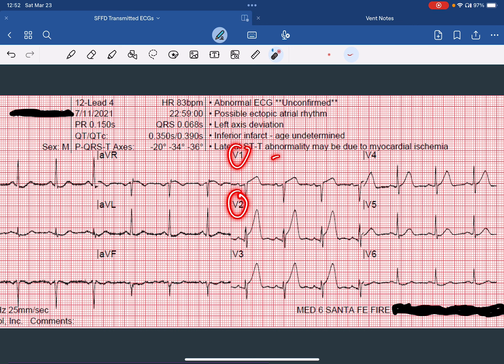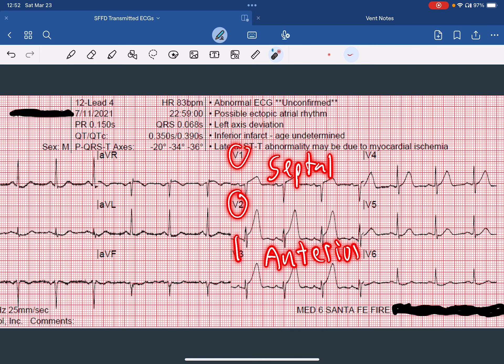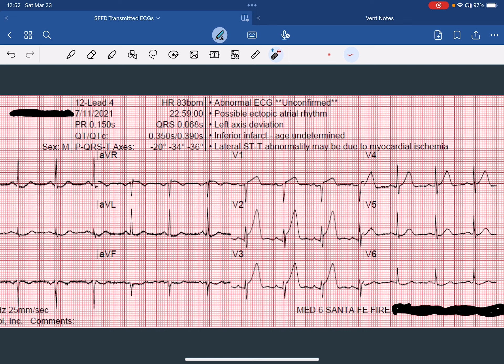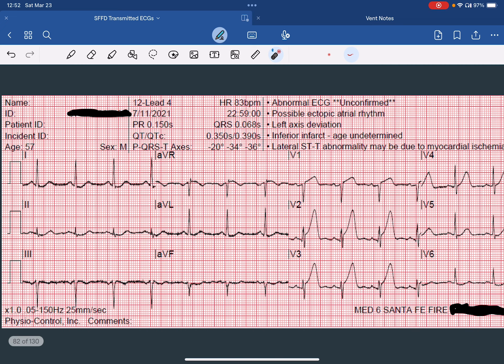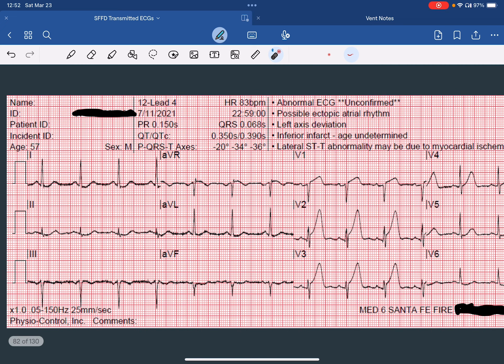Now that we've confirmed ST elevation in two or more contiguous leads, it's time to look for the presence of reciprocal changes. If we think about what's going to be reciprocal to the septal anterior wall of the myocardium, that will be the lateral and inferior aspects of the heart.